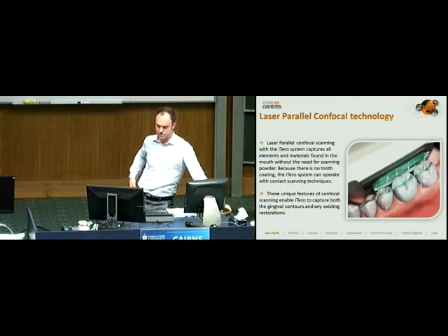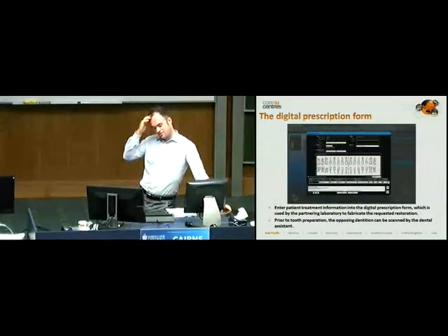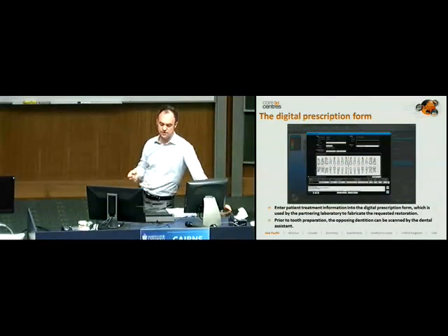And what I'll do is, I won't spend any more time on the technology itself. I think the proof is in the demonstration at the end of this lecture, but if there are any questions, I'll try and answer them as I go along through the demonstration. So, how do you do a digital impression? Now, I'm just going to talk about the iTero, but I have seen the 3-shape system, which is going to be distributed here by Heraeus.